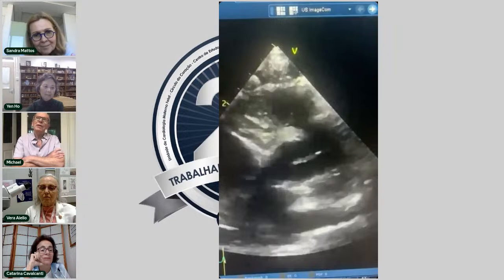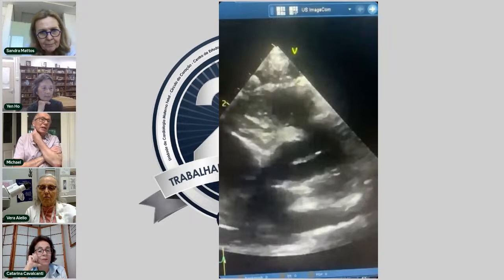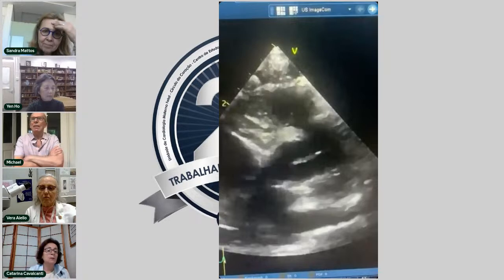And we have a pretty good CT service, very conveniently located, because the acquisition time for a CT is very short. So the baby goes down for a CT, they've done it in 10 minutes. Whereas if you're going for an MRI, the minimum acquisition time is probably 35, 40 minutes. It might be an hour. For a baby, you need a GA. Whereas for a CT, they can acquire it very quickly. So they get very nice pictures of the coronary arteries, providing the heart rate is not too fast. And if the heart rate is a bit fast, they just give some beta blocker just to slow the heart rate down a little.